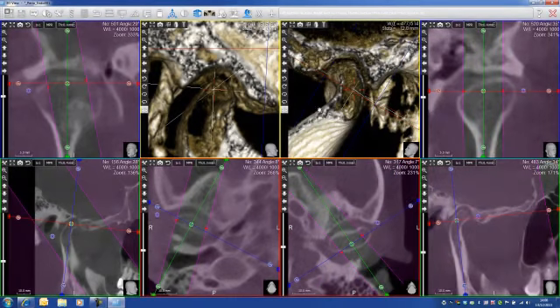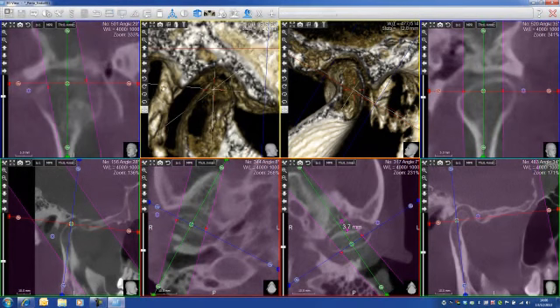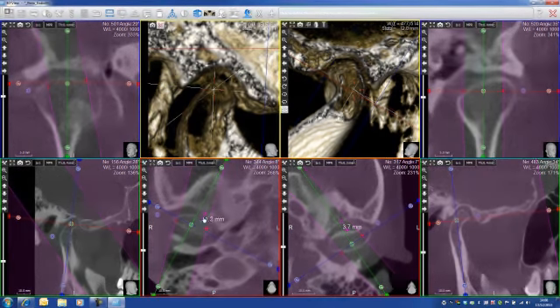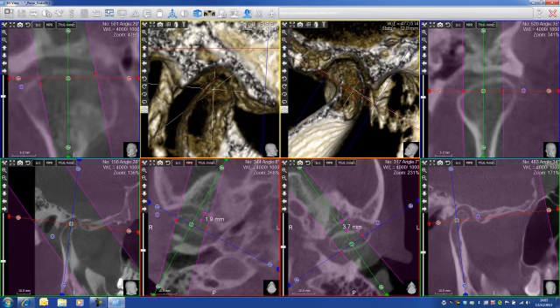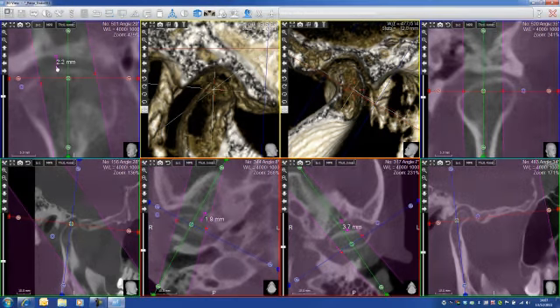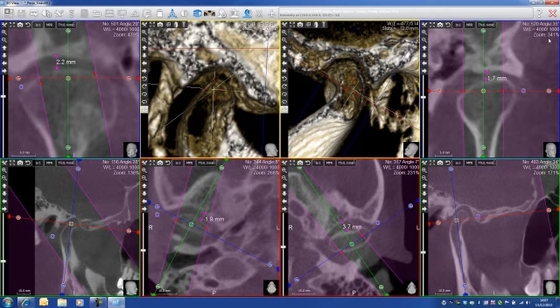And of course, as always, I can use my 2D functionalities to measure at any point what is the difference between my TMJs — to make sure they are symmetrical. The idea is to get the same zoom on left and right condyles, otherwise the measurement won't be precise.